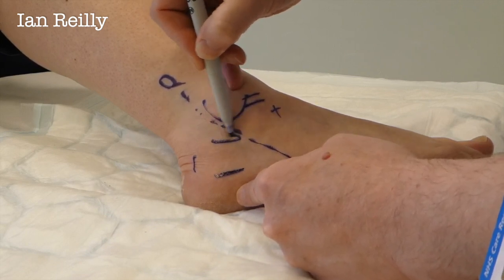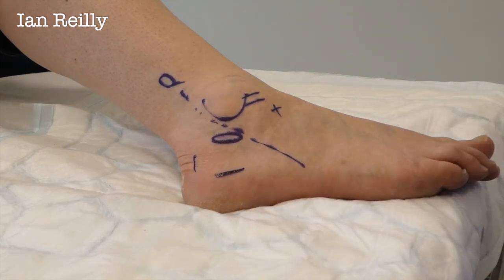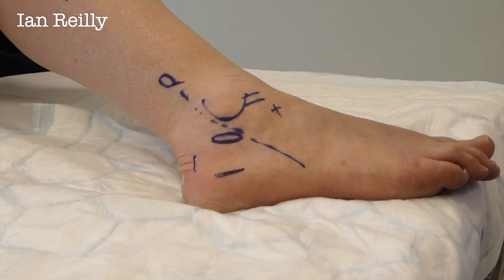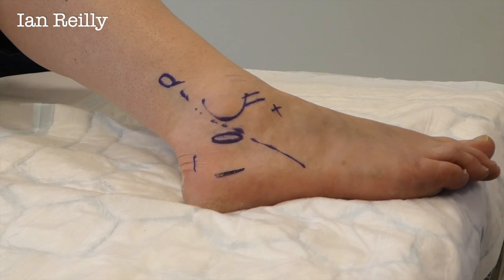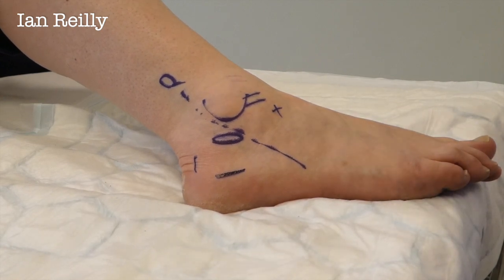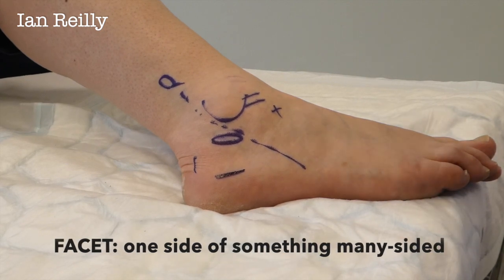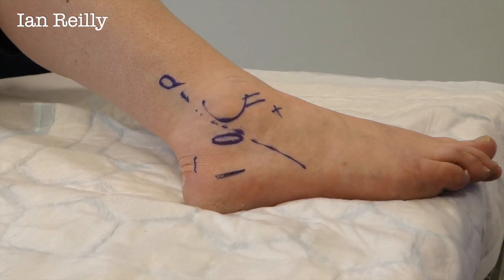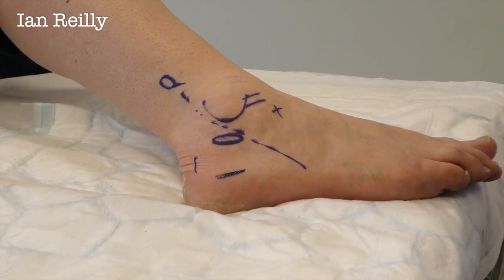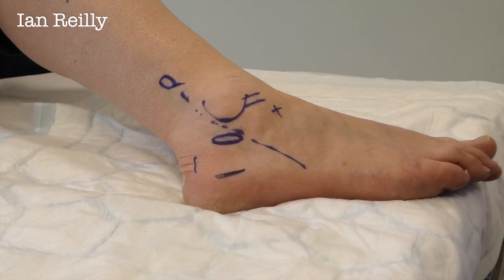And then about this level here we've got what we know as the posterior facet. So the joint is in three bits: a tiddly middle bit, anterior bit, posterior bit. And what the MRI says to you is your posterior bit is a bit cheeky.